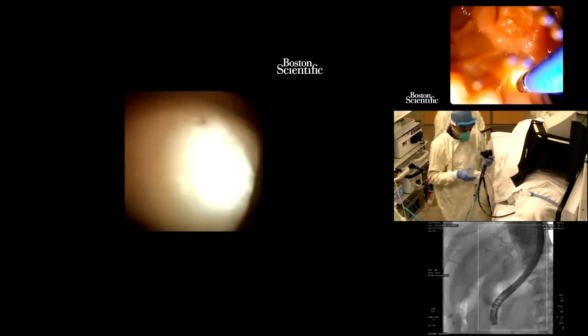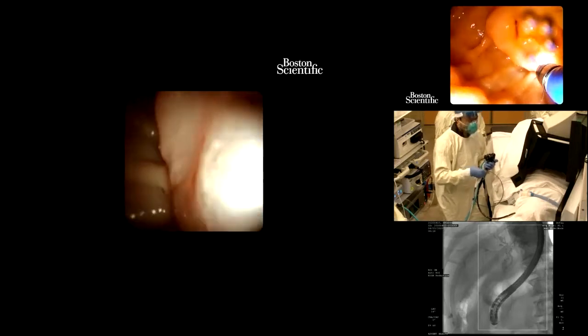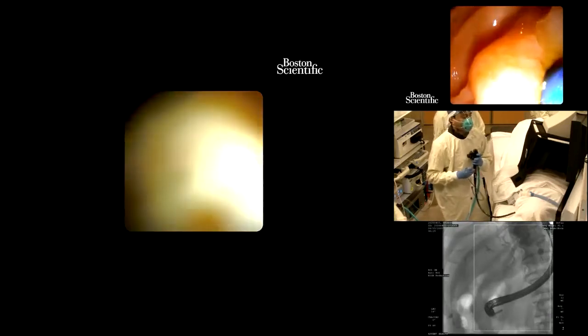So on my endoscopic view, I'm now going to push my scope a little bit to go into the semi-long position to see if my cannulation will be easier. I'm now going to elevate the small knob on my SpyGlass to get a good angle. Now, I'm well positioned on the major duodenal papilla. I'm holding the shaft of my duodenoscope to advance it gently inside to see if I can go in without a problem. If not, I will require a guide wire. But I think I'm able to pass it. I do not have any resistance to passage.